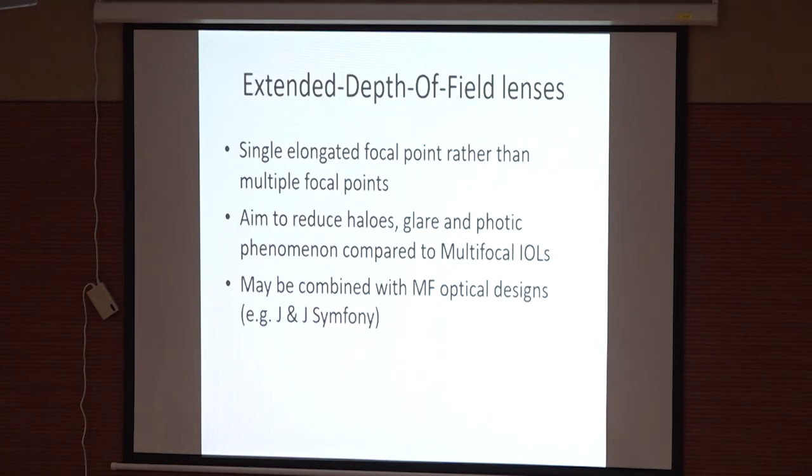Now these extended depth of focus, or extended is more like an extended depth of field, please pardon that. It has a single elongated focal point rather than multiple focal points that we have with the multifocal IOL.